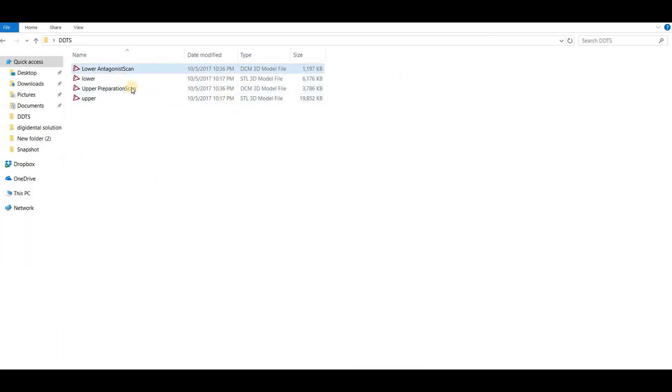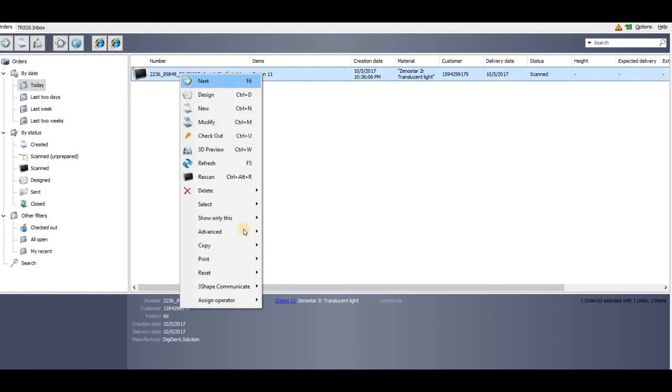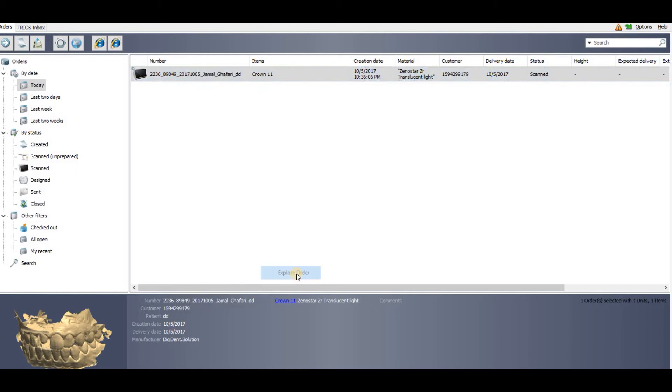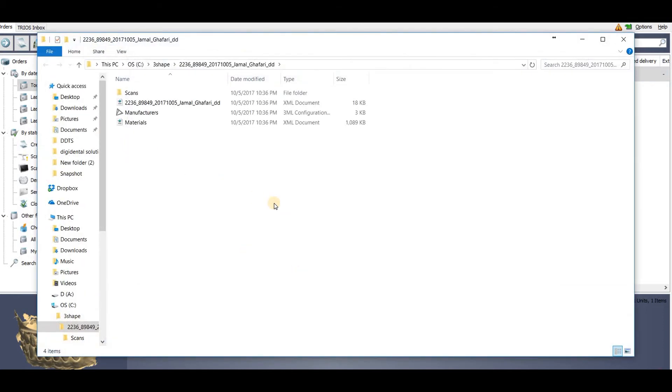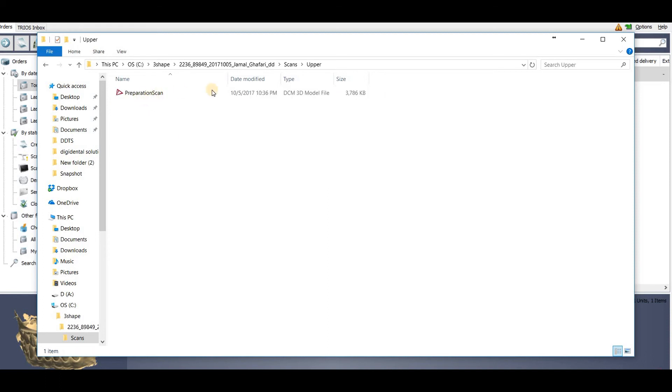Another way: you have to just right-click, go to the advanced menu and explore order. In explore order you will find the scans, and in scans you will find the upper and lower folders. In the upper folder you will find the upper model DCM file, and in the lower you will find the lower model.